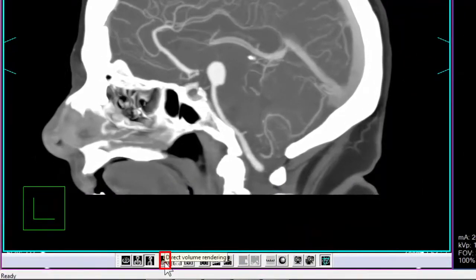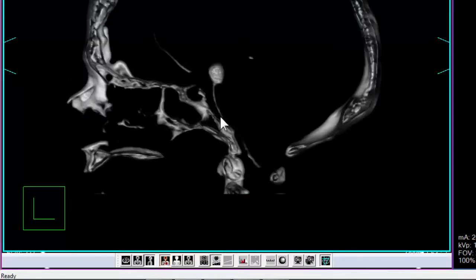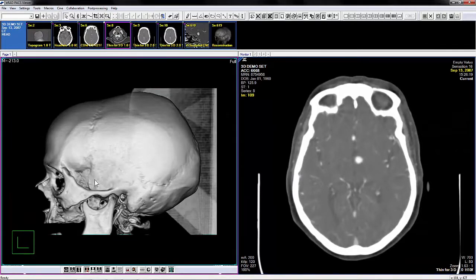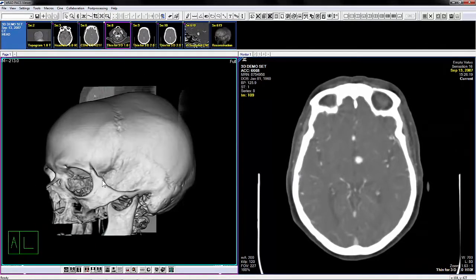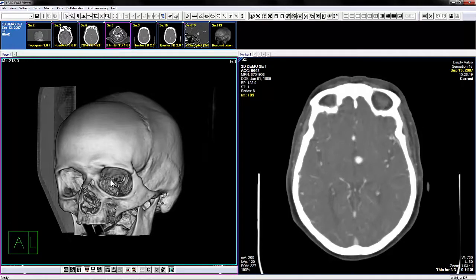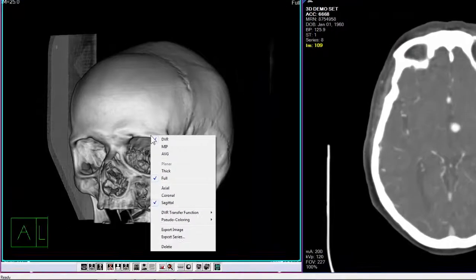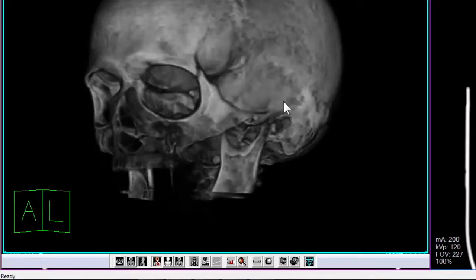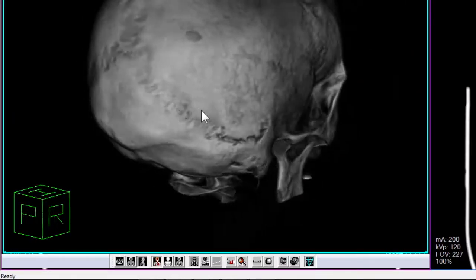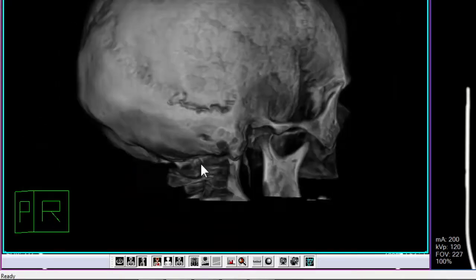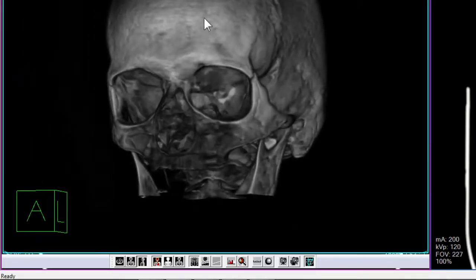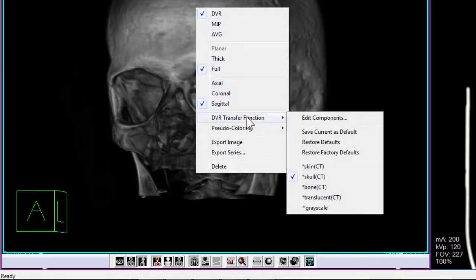This is the DVR icon and its keyboard shortcut is the letter D. DVR displays the image as a fully rendered volume using an applied transfer function. Transfer function presets can be changed by accessing the plug-in's right-click context menu, selecting DVR transfer function, and choosing from the available options. Users can also change their default DVR function from this context menu and enter the transfer function editor to create new or adjust existing presets.